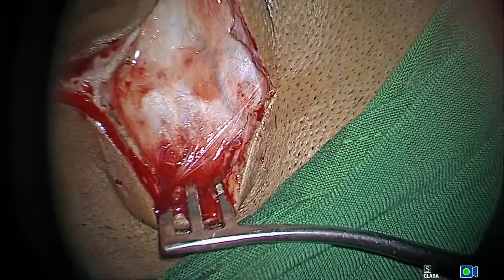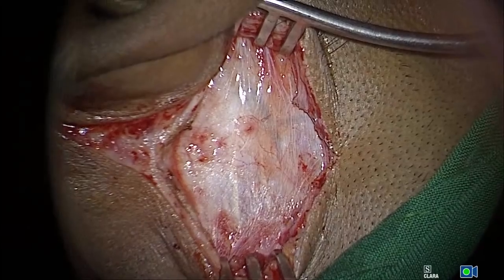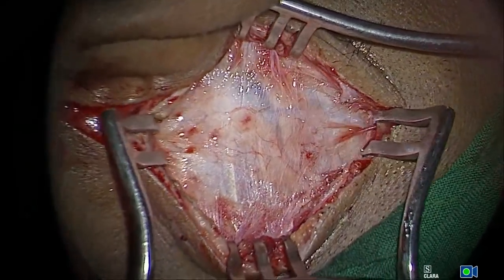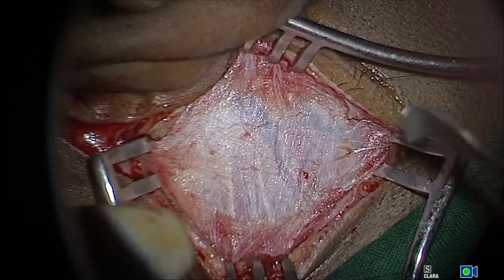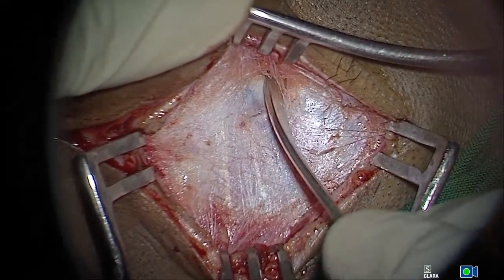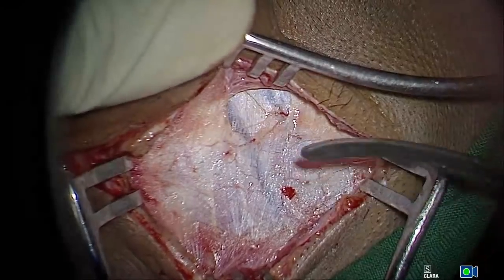So I use a retractor like this. And then the next step is to put the other retractor. You can see how nicely the graft has been exposed. You have the temporalis fascia. This is the temporalis fascia. So you can see that I'm now taking off the temporalis fascia.